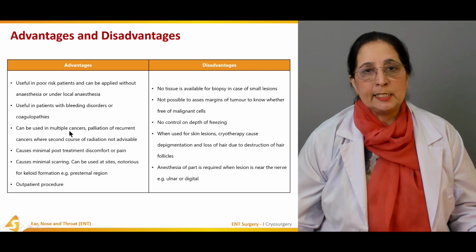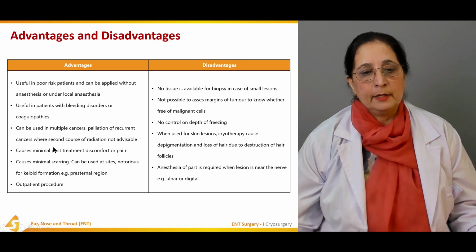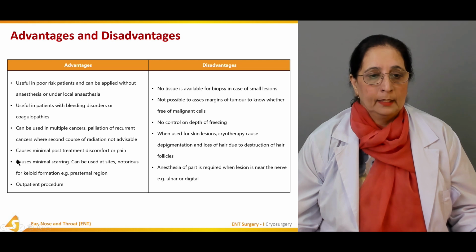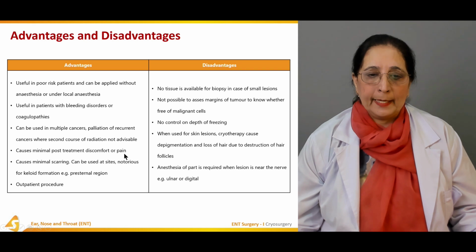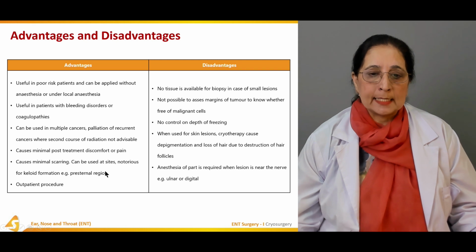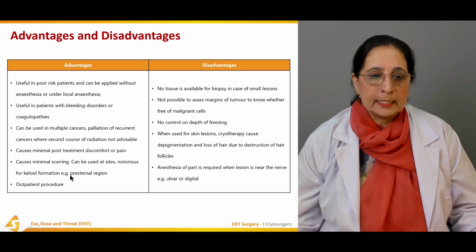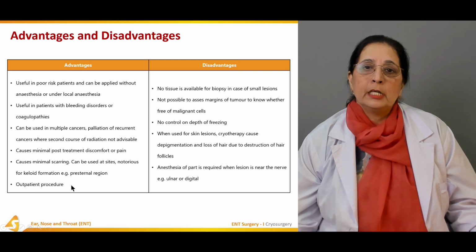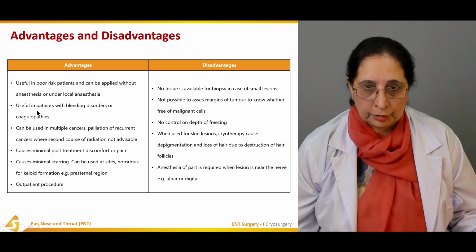It can be used in multiple cancers, and for palliation of recurrent cancers where a second course of radiation is not advisable. It causes minimal post-treatment discomfort or pain, and minimal scarring, so it can be used at sites notorious for keloid formation, for example, the presternal region. And it is an outpatient procedure. So all these are the advantages of cryosurgery.